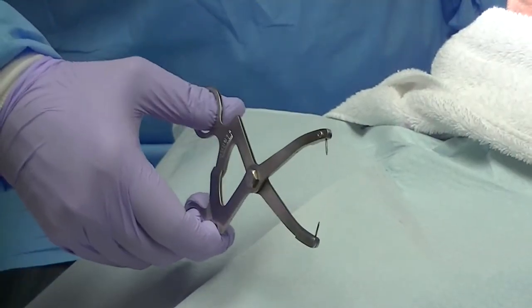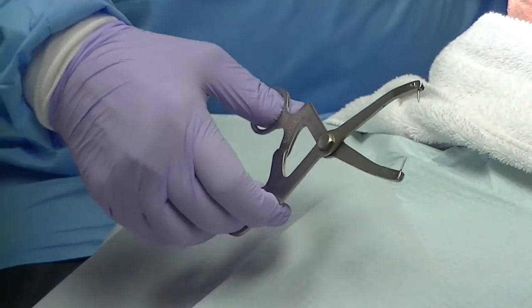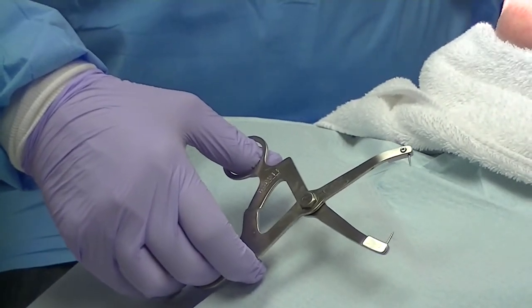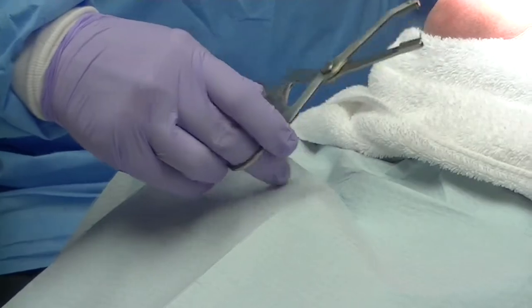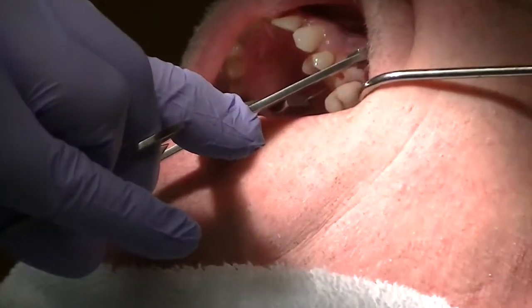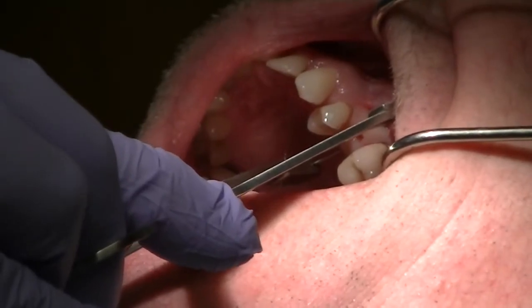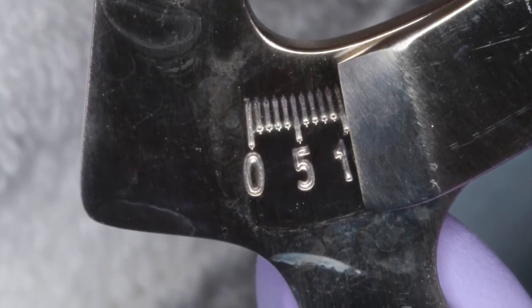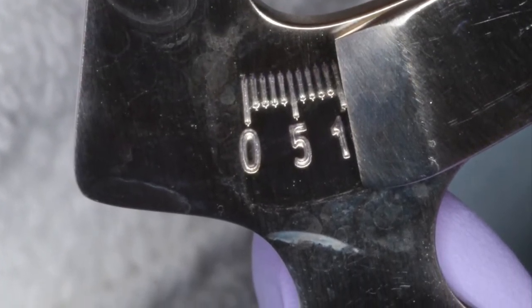Another way of determining the amount of width that we have is the poor man's caliper. After anesthesia, we'll simply take this caliper and measure the horizontal palatal-facial aspect. Here you can see we have nearly a centimeter of width, which coincides very well with what we saw on the CBCT analysis.